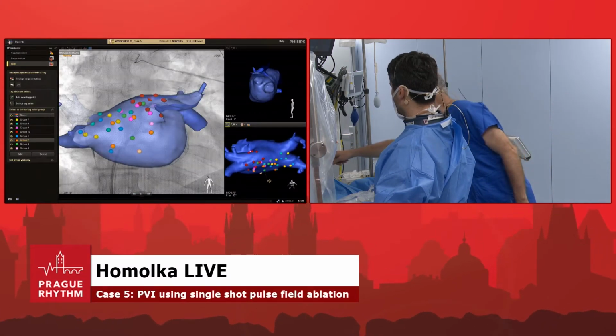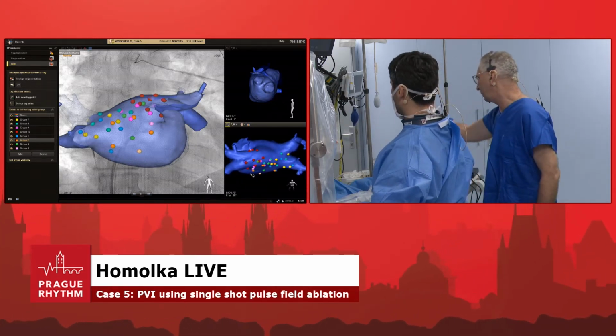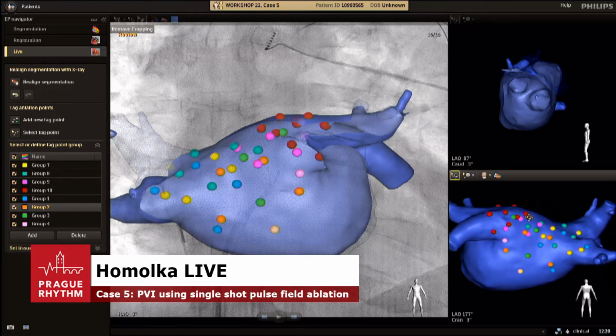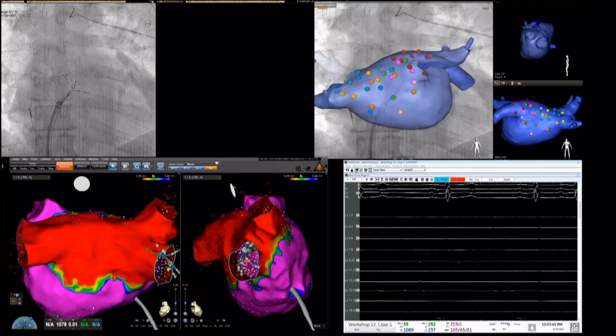Okay, so in the roof, actually on the left, we tried to get on the roof, and we really succeeded. And actually, when you look at the posterior, give me the posterior wall again, PA view, and match the PA view with the Carto. So actually, we really match the lesion formation with the so-called scar formation on the posterior wall. So actually, I am very happy with this. And with this finding, I think that we can finish the case, and we can thank you for the patience here.